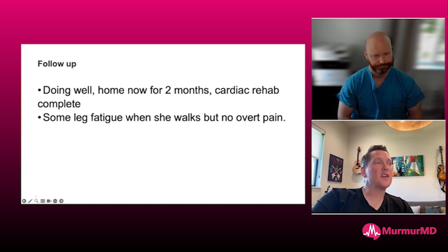Yeah, I think the thing that really brought it home for me with protamine was when I looked at the data, there's actually STEMI data for protamine. Like giving patients with acute STEMI protamine after, of course, they've been appropriately preloaded. And so if protamine works in that population, it's going to work in every population. And having done it in 1,000 cases, I've never had an issue with it. You get occasionally an exaggerated protamine reaction. There's always a small chance of getting a catastrophic protamine reaction, but I think the risk versus benefit, it's one of the most underutilized bleeding avoidance strategies that exists.